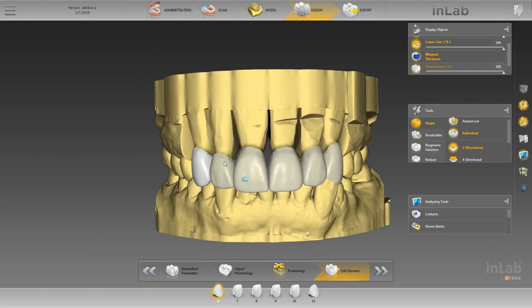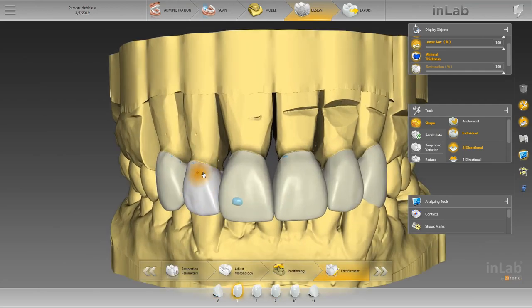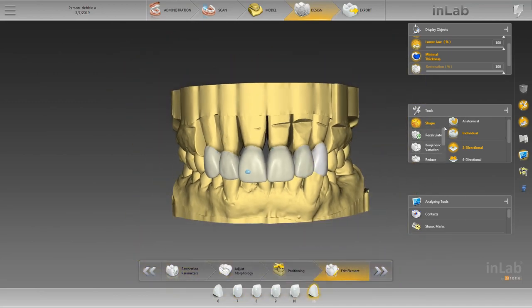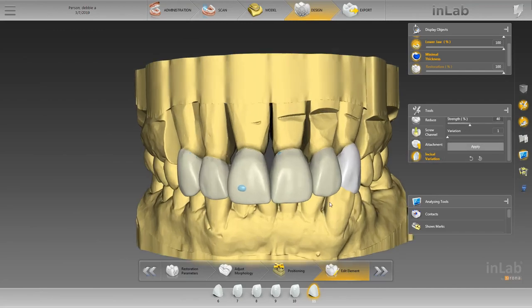Mamelons, anyways, it gives it a nice effect for those puppies. This lateral, we're going to do the same thing, maybe not the same strength. We're going to take this one individually, so, oops, let's go right here.